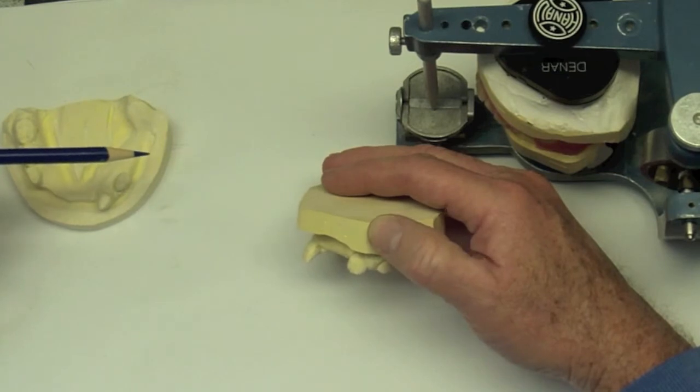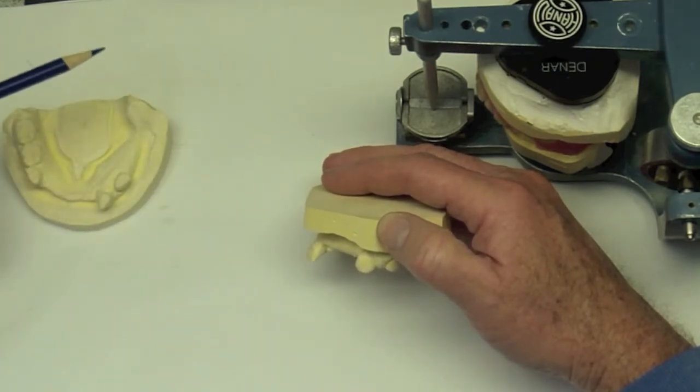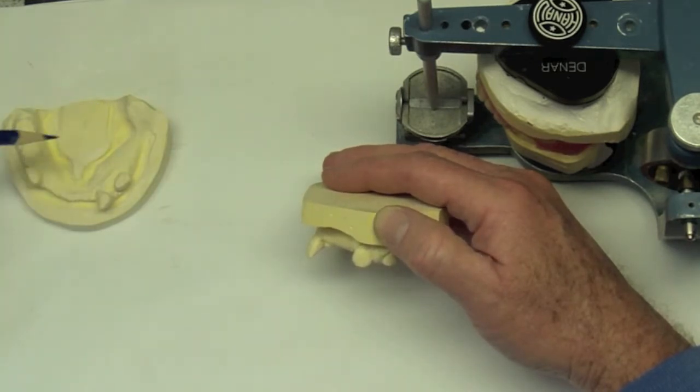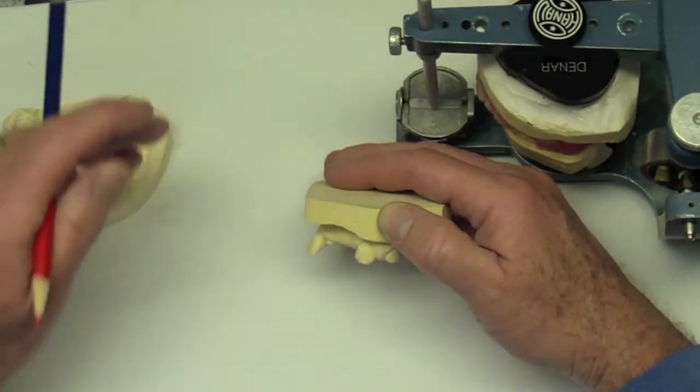The way this is going to be managed is really in two phases. Ultimately we're going to be doing immediate dentures, maxillary mandibular immediate dentures just because of poor positioning of teeth and periodontal involvement of the remaining teeth.